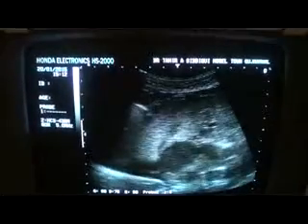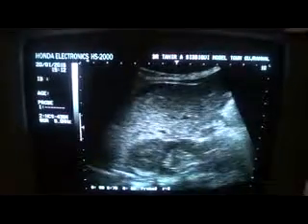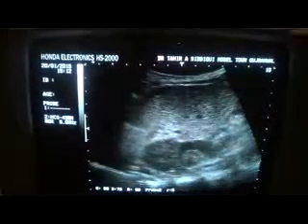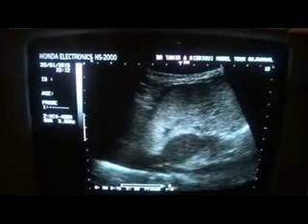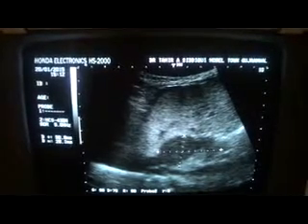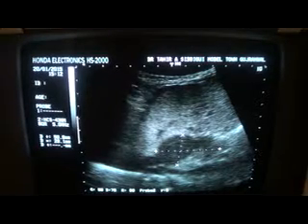I'm going to magnify to show you that this focal lesion, a part of it being echogenic and a part being hypoechoic, relates to the caudate lobe of the liver, because otherwise the caudate lobe is not seen separately. And this is the location for identification of the caudate lobe. What's important to see is that this is not a purely hypoechoic mass. It in fact contains an echogenic area as well. This is an echogenic part in it. This is the true measurement now. So it is mixed echo, in the sense that most of this mass relating to the caudate lobe or segment 1 of the liver is hypoechoic, with an echogenic area protruding into it from its posterior wall.